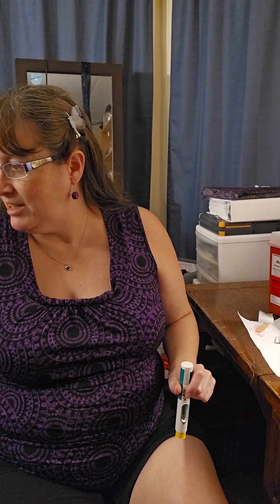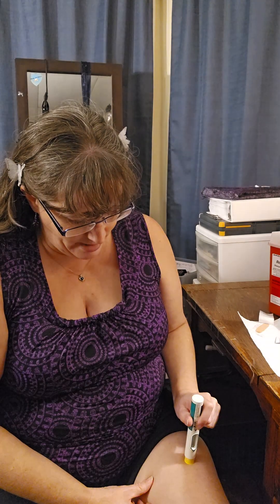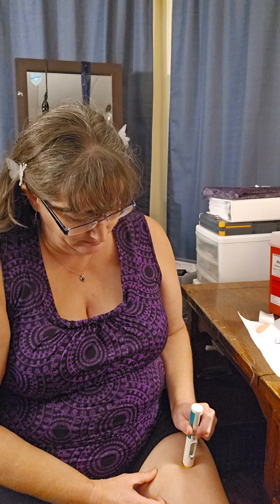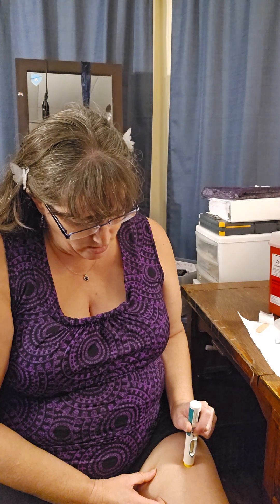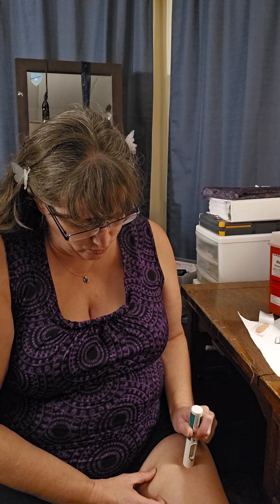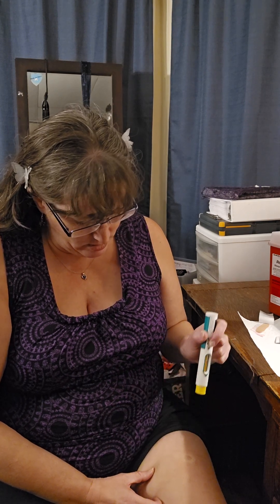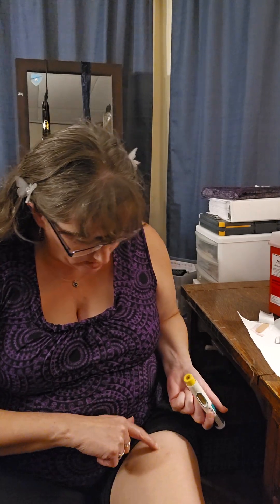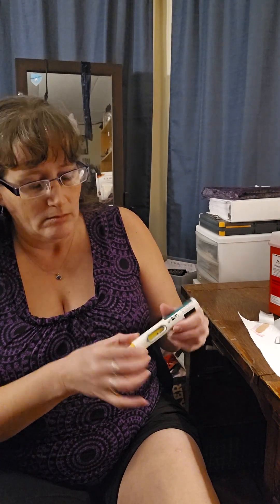Making sure I'm doing it in the right leg — yes, left leg this week. All right, here we go. Oh my... a lot of the stuff is on the outside. Not good. I need to make sure I push it down all the way.